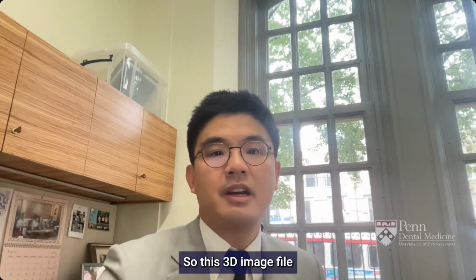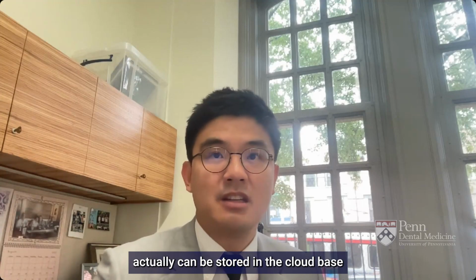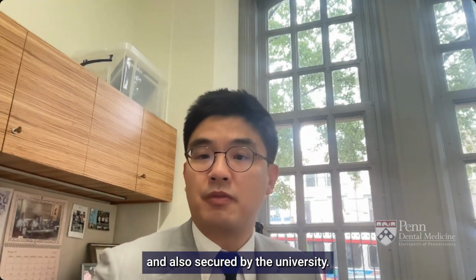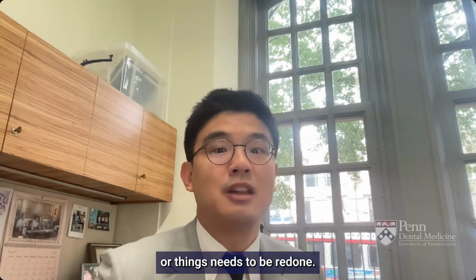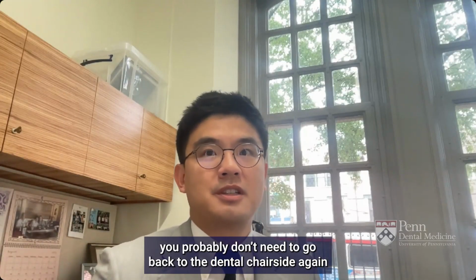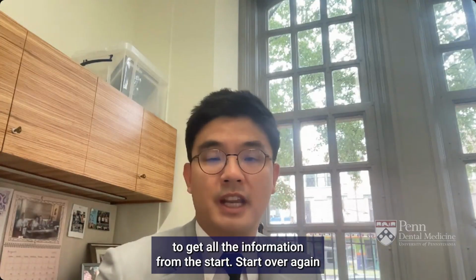So this entire three-dimensional file can be stored in a cloud-based, secure area secured by the university. So in the future, if something bad happens, like an accident, or something needs to be redone, you probably don't need to go back to the dental chair side to get all the information from the start again.